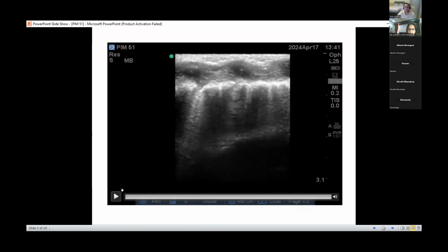This baby was a 36 weeker, 1.9 kg, presented to me almost stable, mild tachypnic, just started on oxygen, IV fluids and some tube feeds later. But at 24 hours of life, the baby was more tachypnic. We put on CPAP and the FiO2 requirement started increasing to almost 70%. So I intubated the baby and did this lung scoring in 6 regions.